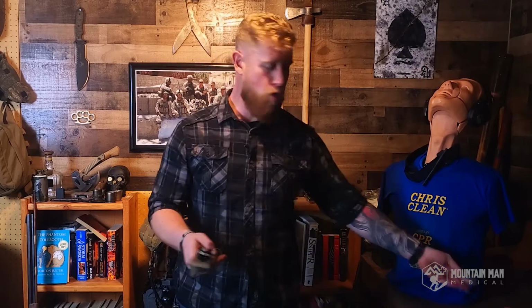All right, now let's see how we're going to get this put on. And you can see, I'm going to apply this to myself one-handed. And we have here a thumb loop. And if I'm going to put this on somebody else, or I'm going to put it on my own leg, I'm going to use this thumb loop to hold the tourniquet in place while I crank this strap down. You can also use your teeth if you're applying it to your own arm. And that's how we're going to try that out right now.